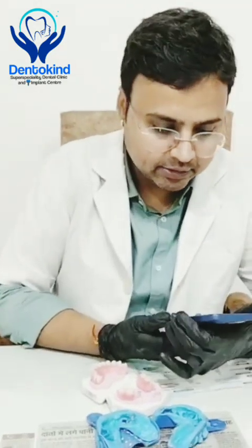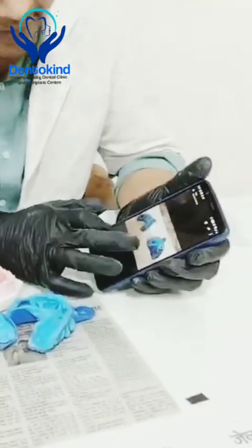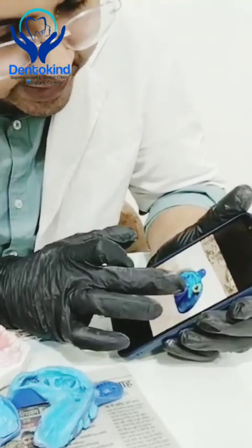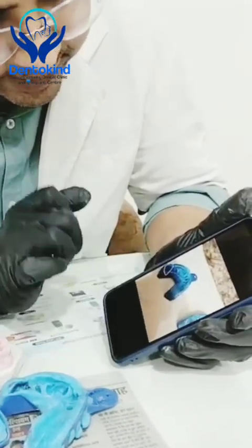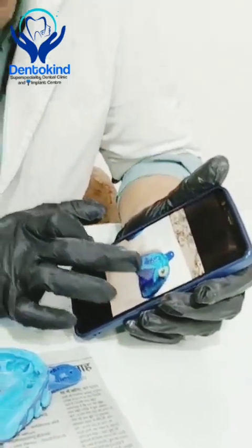One of their two teeth was mobile, so they sent us this impression. After sending the impression, they also sent me an image. Let me show you what that image was — they sent me this image showing which teeth they wanted omitted from the impression.